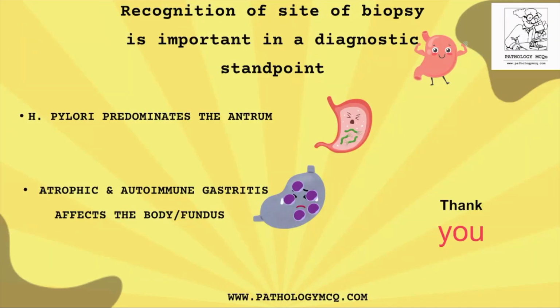So in conclusion, recognition of the site of biopsy is important from a diagnostic standpoint because H. pylori, which predominates in the antrum, may be missed if a biopsy from the fundus or the body is received, and also if a biopsy from the cardia is received, it may be mislabeled as chronic gastritis because of the natural presence of lamina propria and its inflammatory infiltrates.